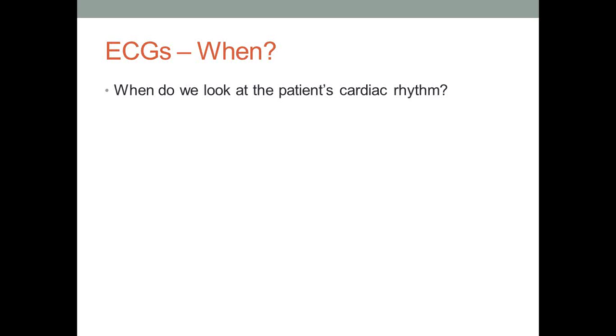So a lot of this will happen simultaneously, and we can run through a scenario in class to show you what that would look like. But keep in mind, as the attendant, your partner generally will get that stuff done for you. There are a number of medics who like to apply the cardiac monitor as they're asking questions. It's completely up to the medic and how they like to flow their call.